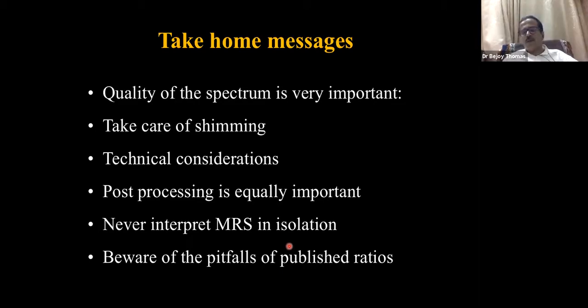If you report MRS in isolation, not looking at your MRI images, you are going to end up in trouble. And beware of these pitfalls and of the published ratios. If you look at somebody else's published ratios, they may not work for you on your machine.